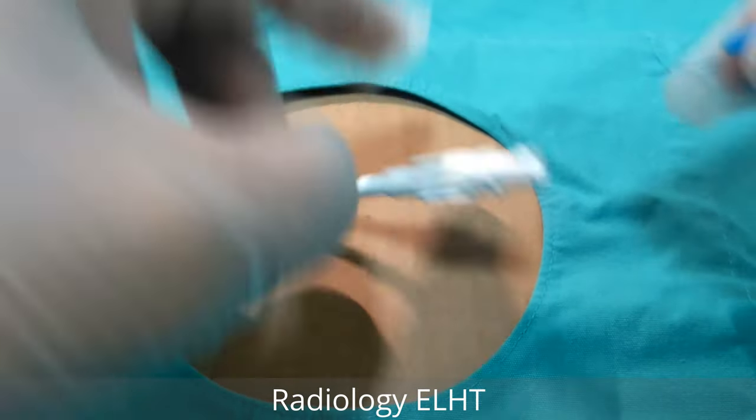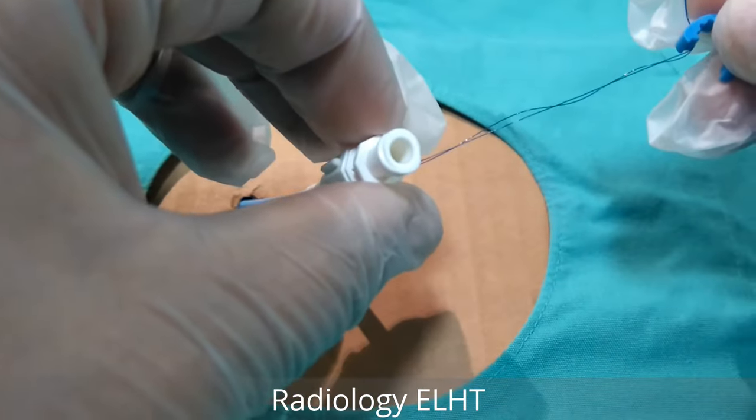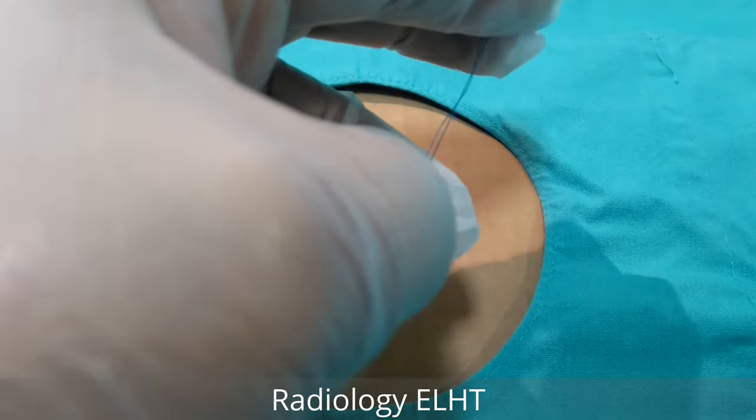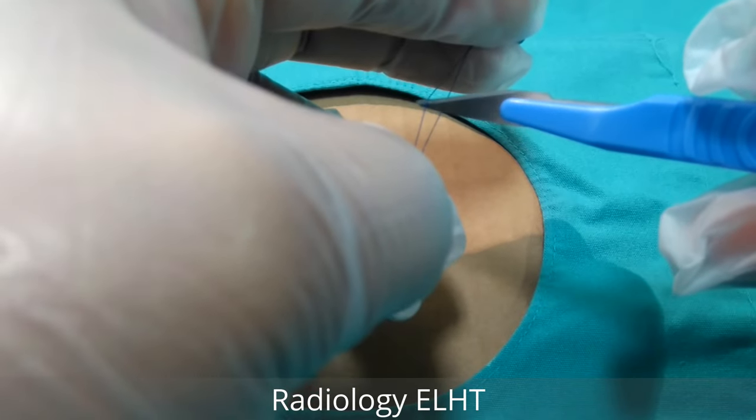Unwind the suture. Two sutures attach to the clip. Using a scalpel or scissors, cut one of the sutures.